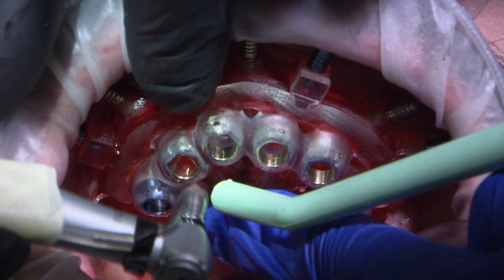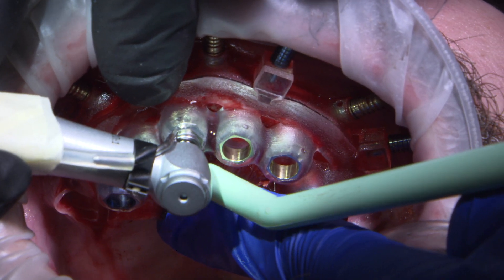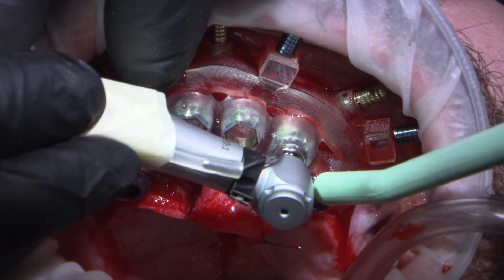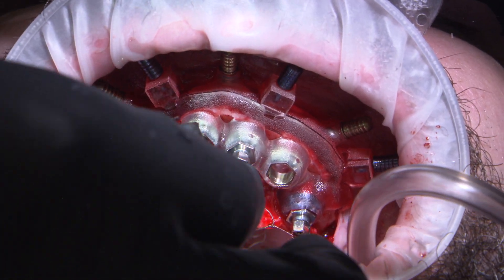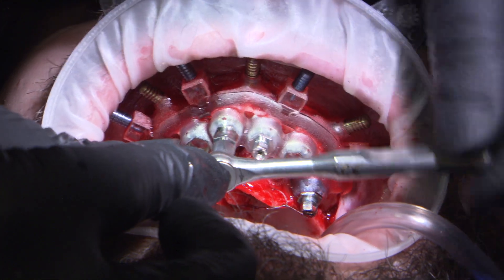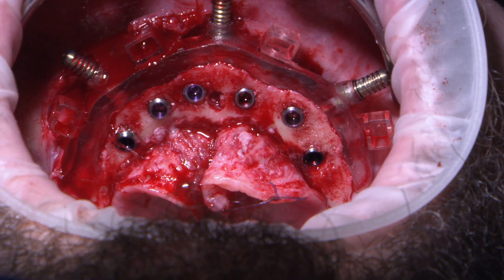With the guide secured, the osteotomies were sequentially drilled following the approved digital treatment plan. The drilling sequence was performed according to the pre-planned guided surgical protocol. Hahn tapered implants were placed with ease, being sure to align the hex of the implant mount with the hex of the surgical guide sleeve. After the implants were placed, the interlocking pins and the osteotomy guide were then removed.